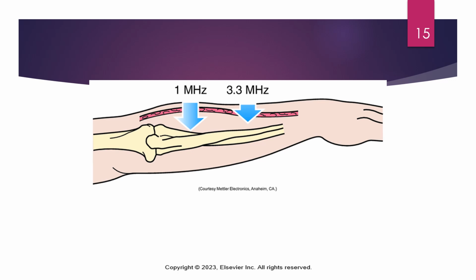If you think back to our anatomy class, and I know looking at the forearm was a little bit rough for you all, you're going to have to get back in and look at those different structures, because we're going to ask you to identify which parameters to use based on what we're targeting in our treatment. If you think of that common extensor tendon on the posterior side of the forearm, we're going to target that structure with a more superficial setting, 3.3 megahertz. But if we were trying to get deeper into the layers beneath those superficial muscles, we're going to use something like 1 megahertz.